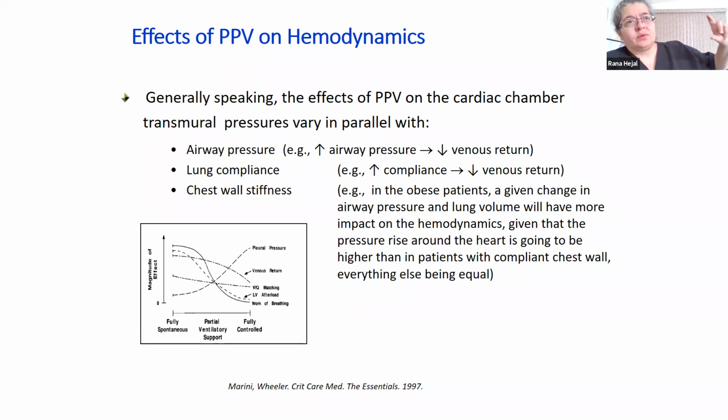Either if they were spontaneously breathing or even on the ventilator. And on the ventilator, it's even worse because it's kind of these pressure swings, you cannot even measure them. So for those settings, in the earlier courses of their illness, sedation and paralysis becomes crucial. Once you sedate and paralyze them and take their effort off, you will have the capacity to measure or monitor their lung mechanics with compliance and resistance. And according to your findings, you will proceed.